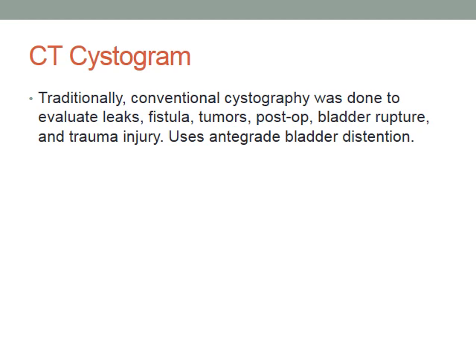Conventional cystogram or other pelvic studies use antegrade bladder distension via IV contrast or oral contrast, and this usually takes a lot of time to fill the bladder. So initial attempts to diagnose bladder trauma with CT and IV contrast administration showed decreased sensitivity compared with conventional cystography. This was due to inadequate antegrade bladder filling from renal excretion. They also tried delayed imaging, which allowed further bladder distension. However, this also resulted in increased scan times, which is critical for multi-trauma patients.